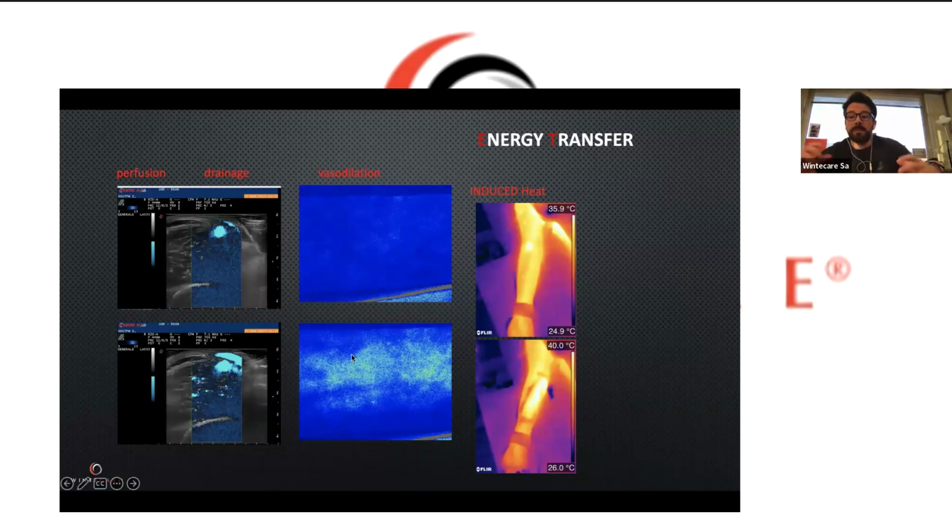This turns into a perfusion of muscle tissues going on the surface. Okay, so what we see here in laser speckle is the reflection of light of capillaries that are filled up with blood. Okay, if we are pushing with the power, we are also able to increase the temperature strongly.